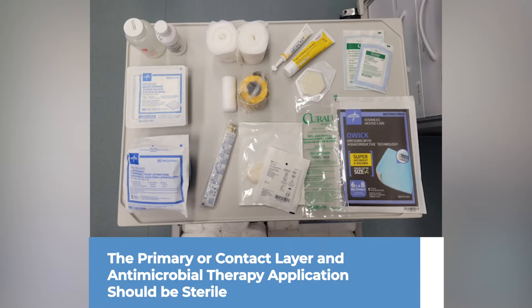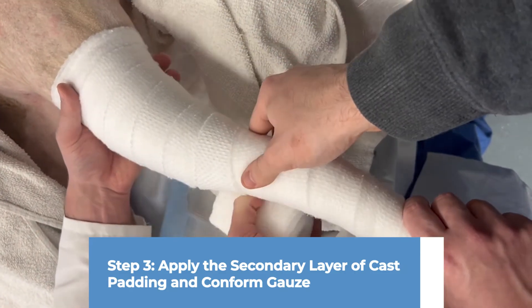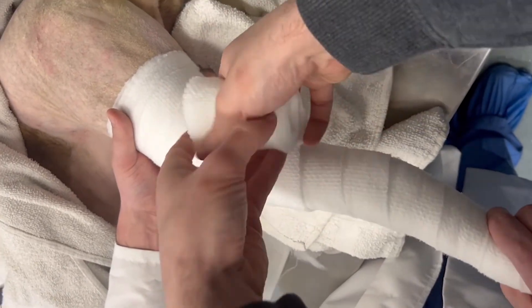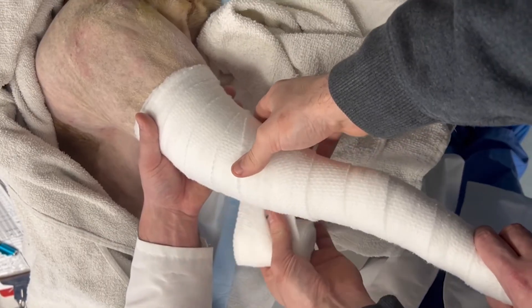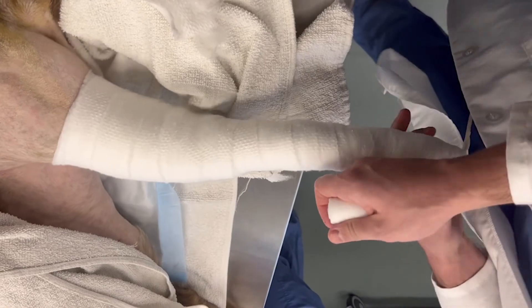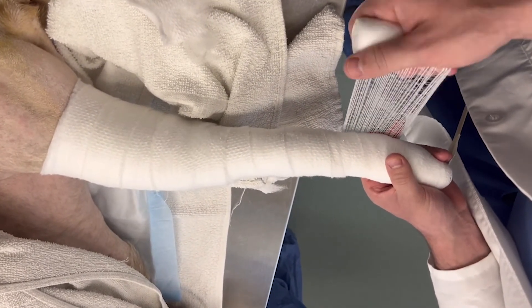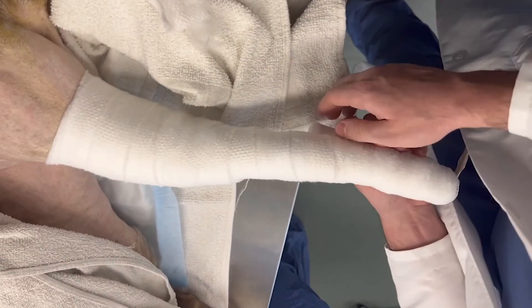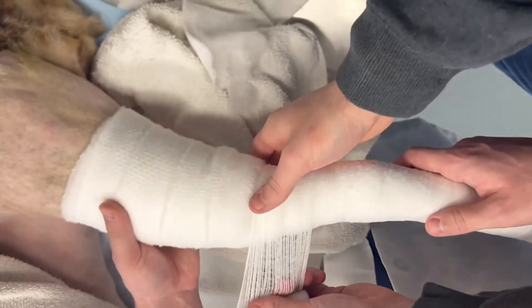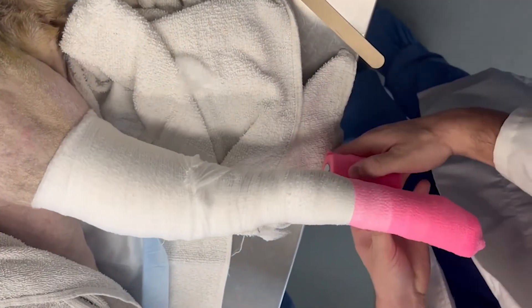Along with the primary or contact layer, the secondary layer of a modified Robert Jones bandage consists of cast padding and conform gauze. These layers provide compression to the bandage, so it's important that they are applied properly. These layers will be applied distally to proximally on the patient's limb. Cast padding cannot be applied too tightly — otherwise it'll just rip — but conform gauze can be applied too tightly, so it is important to only tighten the conform gauze in one direction. Each layer should overlap the previous layer about 50%.